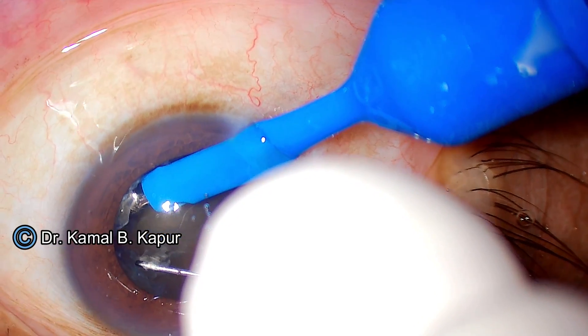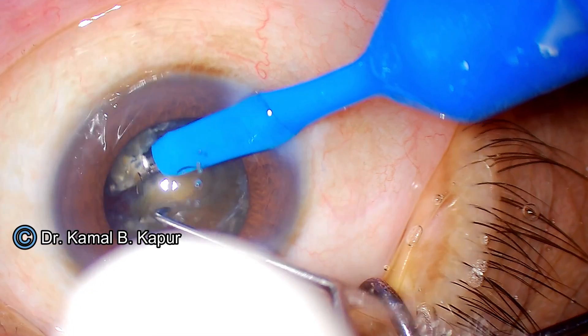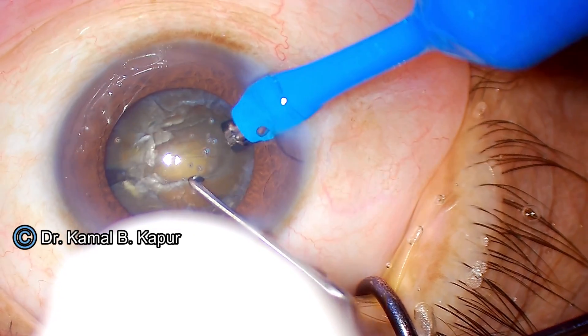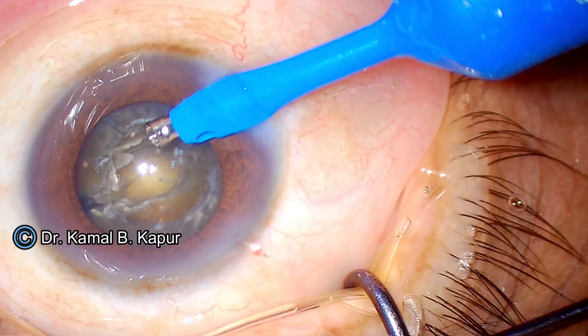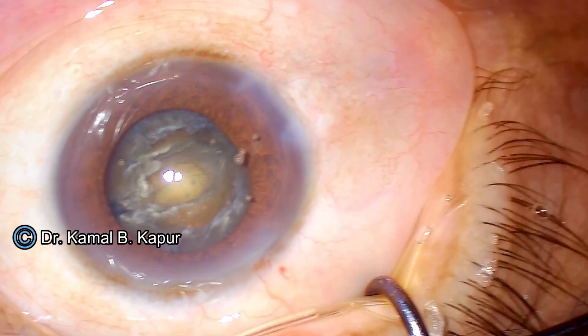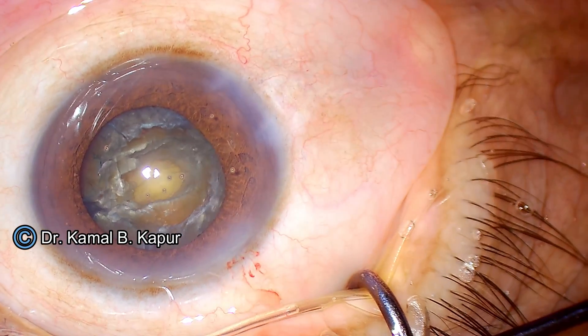We perform a powerful, slow, controlled chop making sure there is no pressure on the posterior capsule — just a slight separating movement. As you can see, since the nucleus is very hard and thick, we did not get adequate depth of the crack. So before proceeding to a manual crack, we will ensure — before removing the irrigating instrument — that we instill viscoelastic into the anterior chamber.